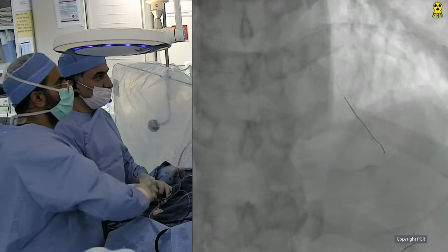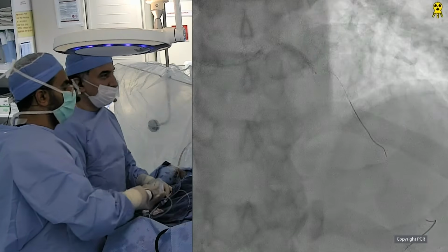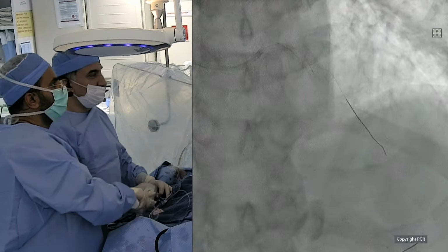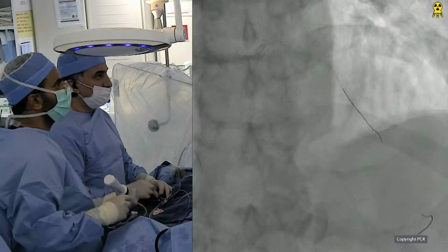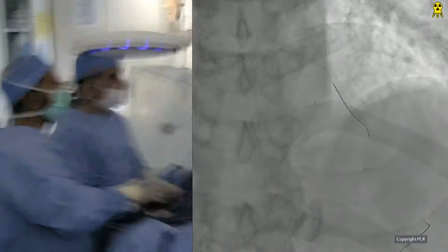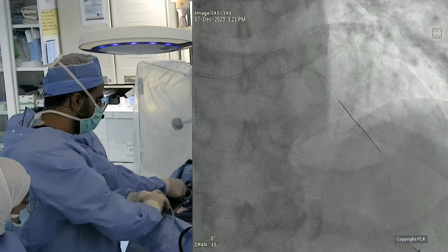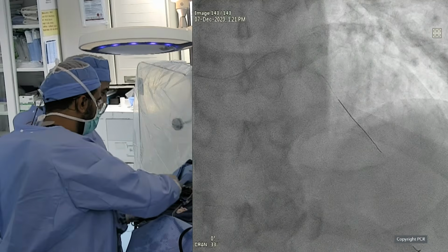We know flow is important for the patency of the proximal stents as well. So I'd be concerned. The distal part of the LAD didn't seem to be so involved by plaques. We'll see what happens when the proximal bit is done. The balloon inflated goes easily. What was the size of the balloon, Hussein?